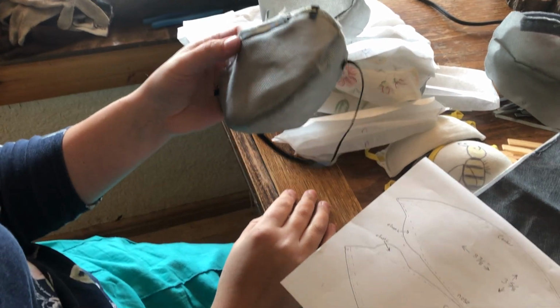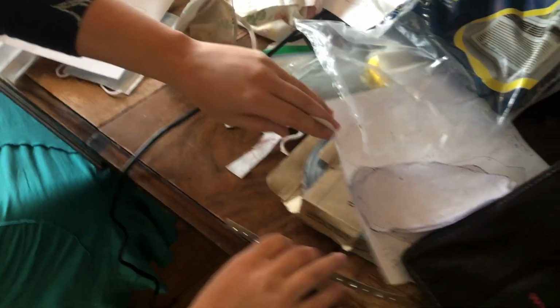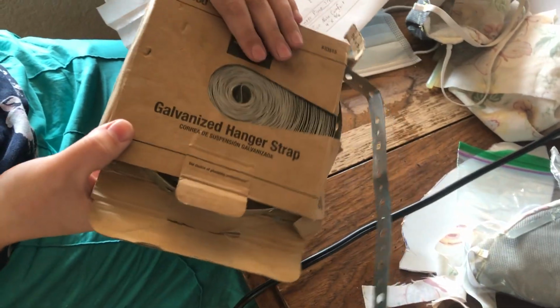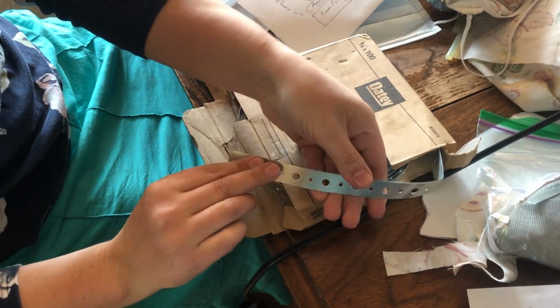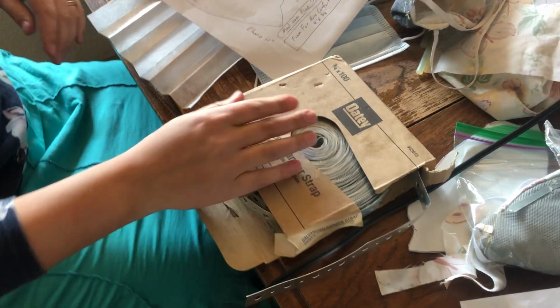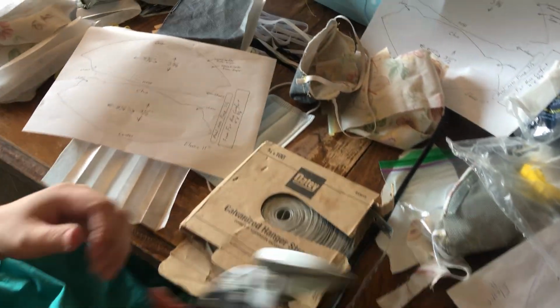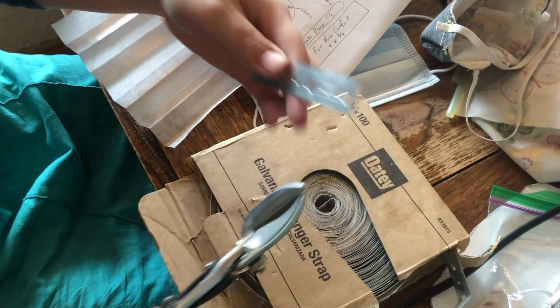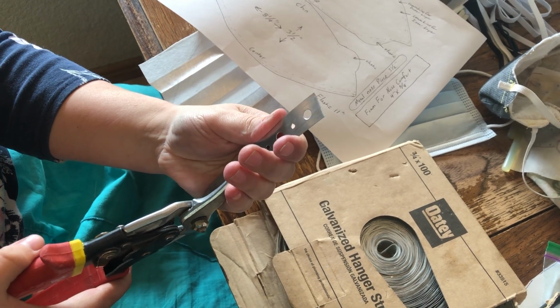Oh, the metal. Where'd you get your metal? The metal. Oh yes. So the metal is another contractor's item here. Compliments to my husband. This is galvanized hanger strap. It's also called plumber's tape. It is a strap with holes in it. It's 3/4. This is a 3/4 by 100. I'm not going to run out of metal. That will be the least of my worries. Got a pair of snips. You've already got a bunch of them cut. Yeah. Cut a piece of metal and then just cut along and get rid of the holes.